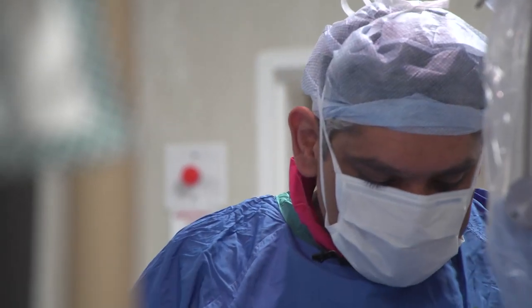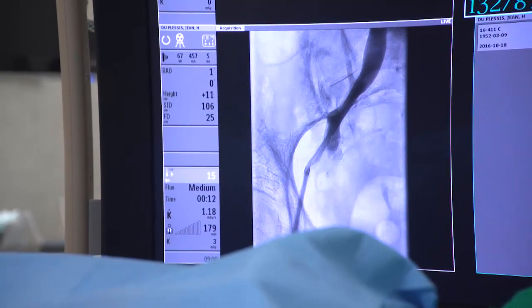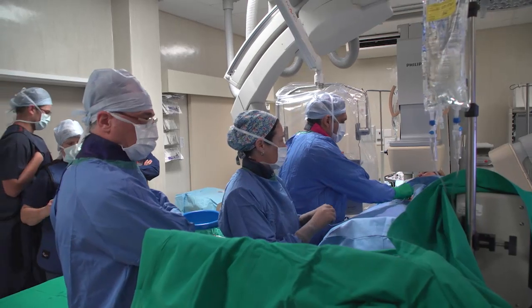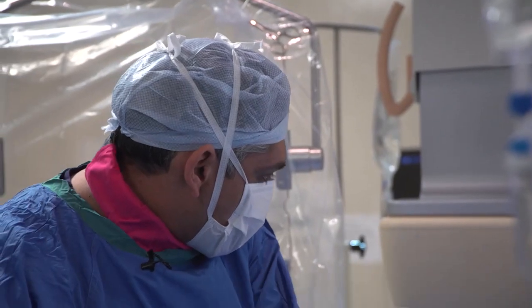We're accessing the heart from the groin to put in the pacemaker. Traditionally, we would normally be doing that from slightly more cranial, which is really from the shoulder, or sometimes even from the neck. And so that makes this procedure very different. But the procedure, on average, is supposed to take around 20 minutes.